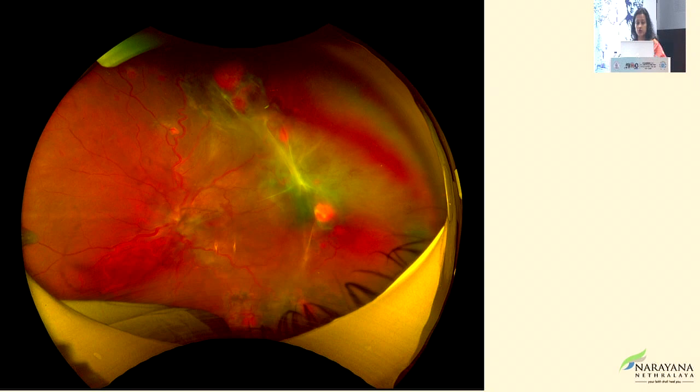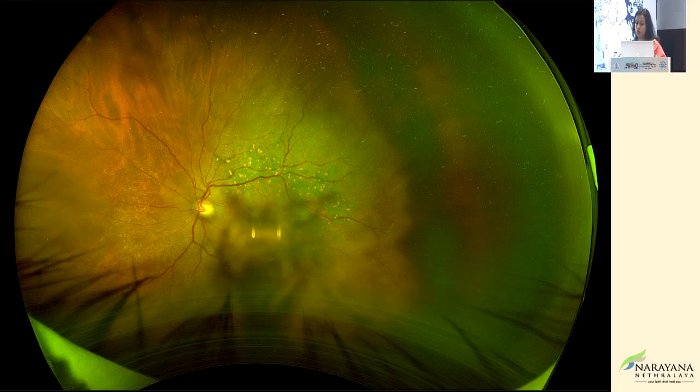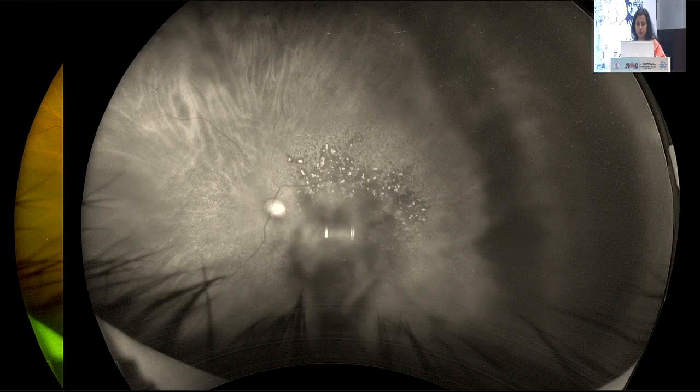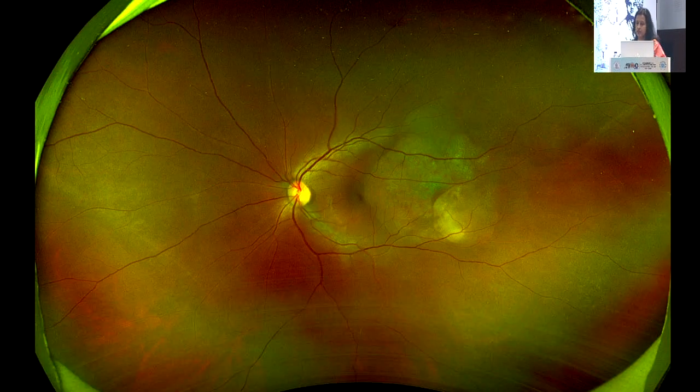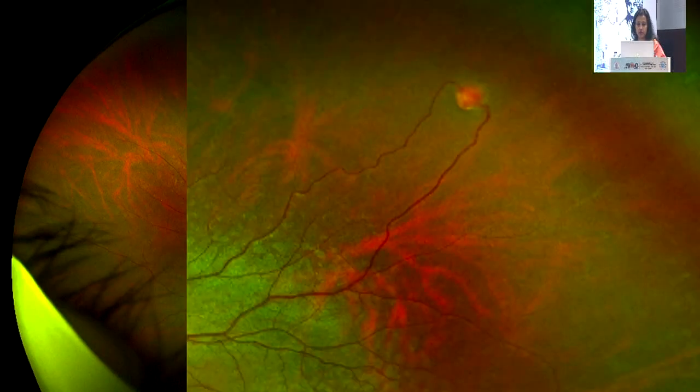This is a patient with VHL, and we counted, I think, at least 21 to 22 tumors across, and this was a one-eyed patient. When we finally had to take this patient up for surgery, the parents understood, because it was a very young patient, the severity of the condition. Here again, sphenoid ridge meningioma, METS, so beautifully demonstrated here. Left breast carcinoma here, a subretinal mass that you can see, angioma with a feeder vessel there.